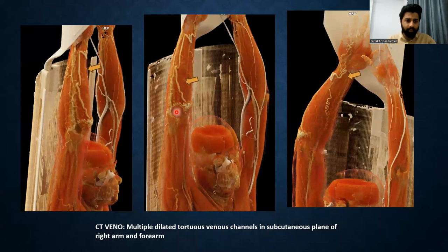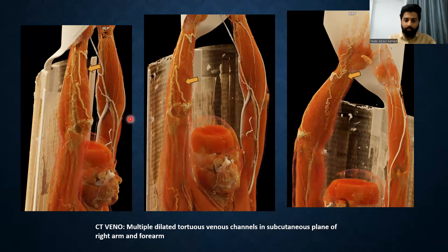This is a 3D reconstruction image showing the multiple dilated tortuous venous channels over the right upper arm and forearm.